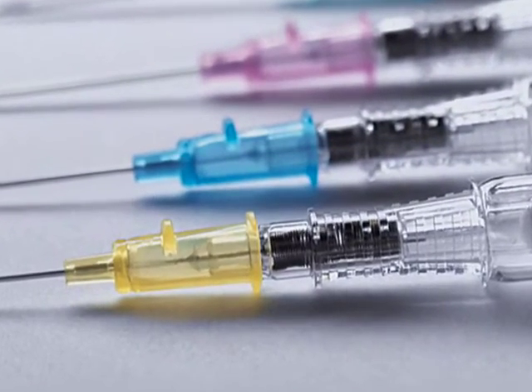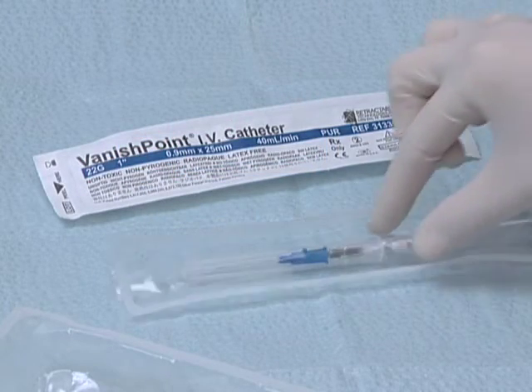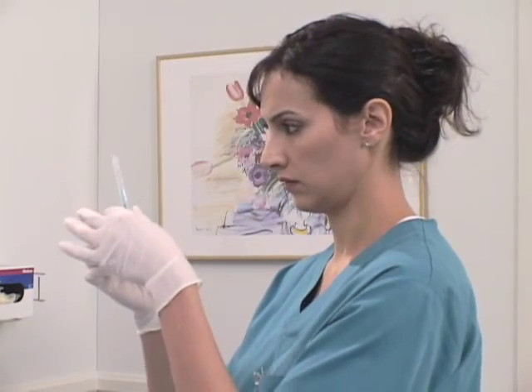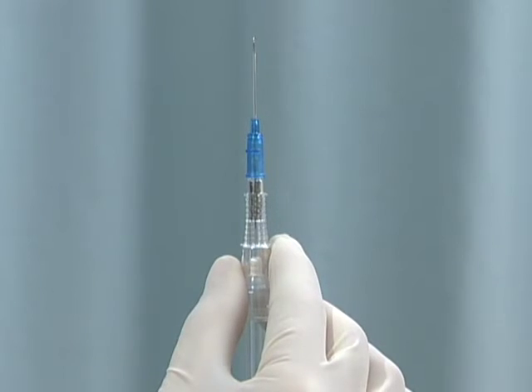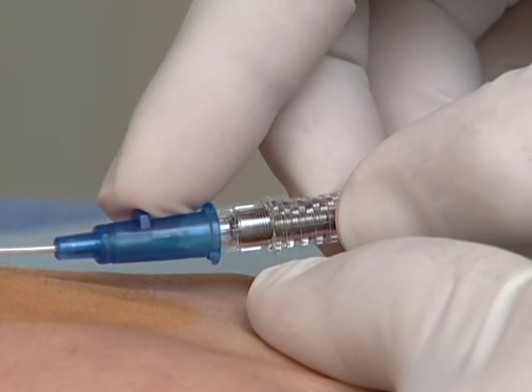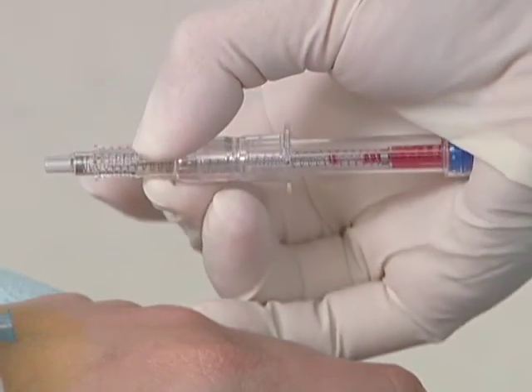Hold the Vanishpoint IV catheter device with your fingers positioned as shown on the finger grips of the housing. Keeping the fingers well behind the needle, perform the venipuncture. Observe for blood return, then advance the catheter slightly to ensure full catheter entry into the vein.